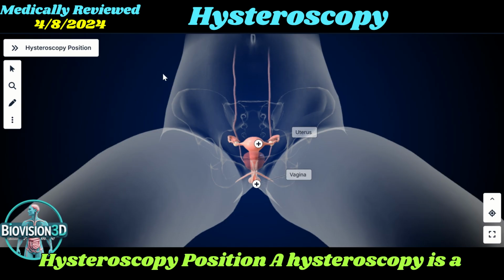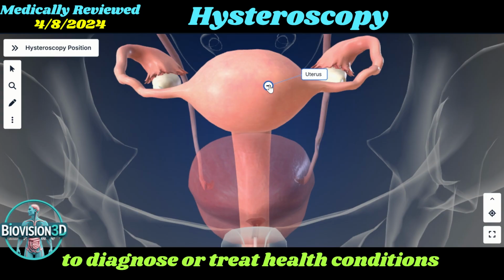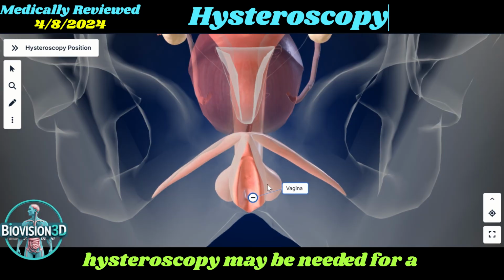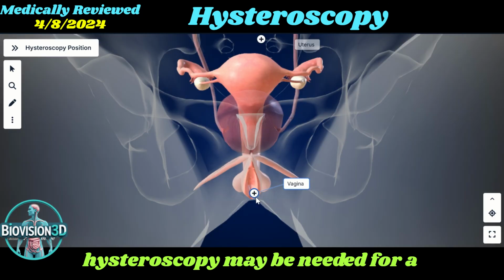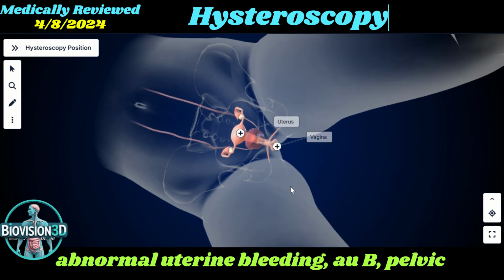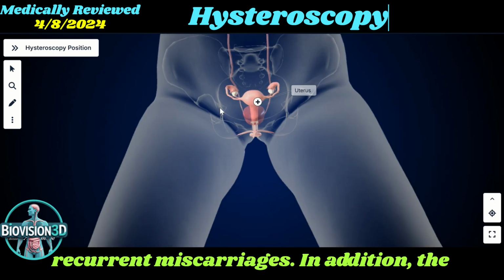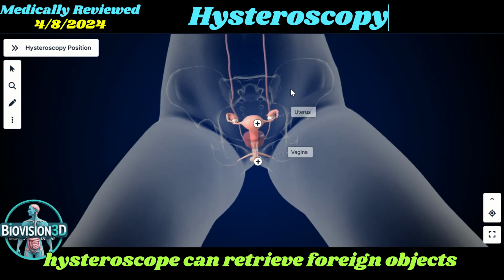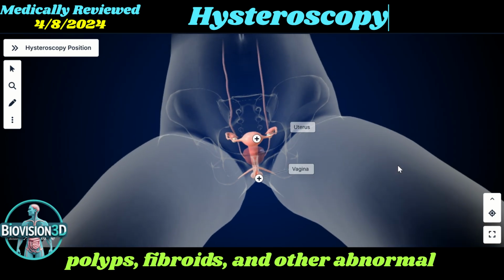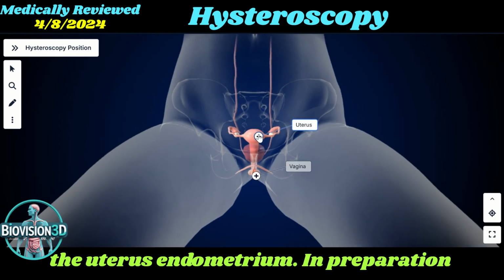Hysteroscopy position. A hysteroscopy is a minimally invasive medical procedure used to diagnose or treat health conditions involving the uterus or cervix. A hysteroscopy may be needed for a variety of reasons, including evaluating abnormal uterine bleeding, AUB, pelvic pain or bloating, infertility or recurrent miscarriages. In addition, the hysteroscope can retrieve foreign objects such as contraceptive devices and remove polyps, fibroids, and other abnormal growths from the inner lining of the uterus, the endometrium.